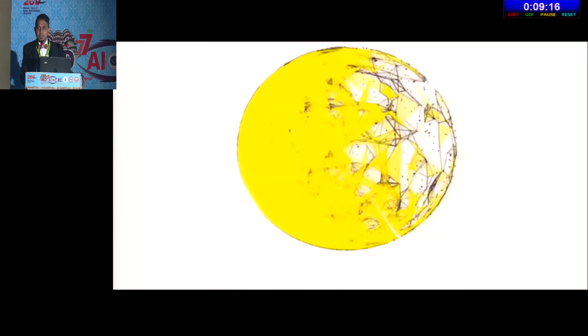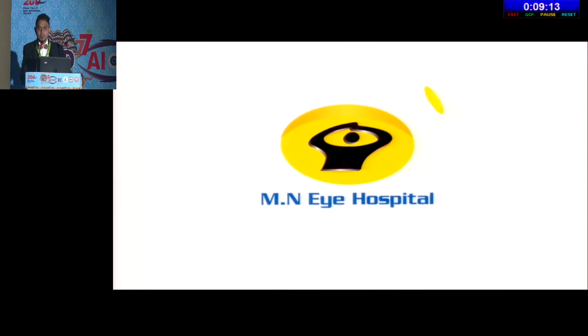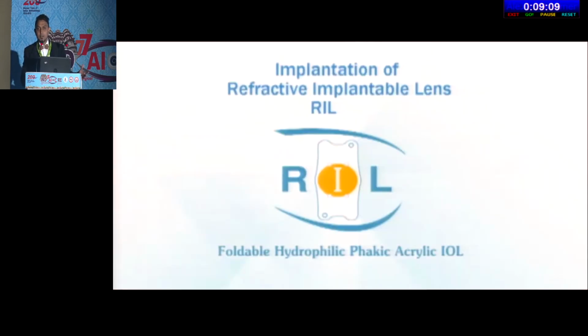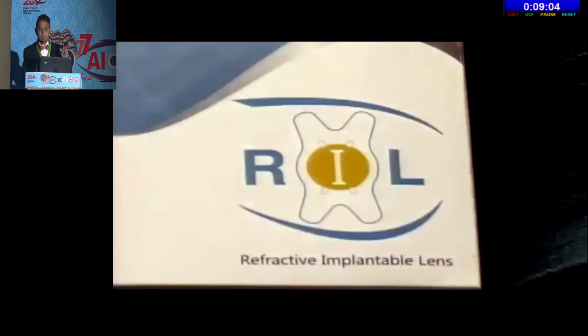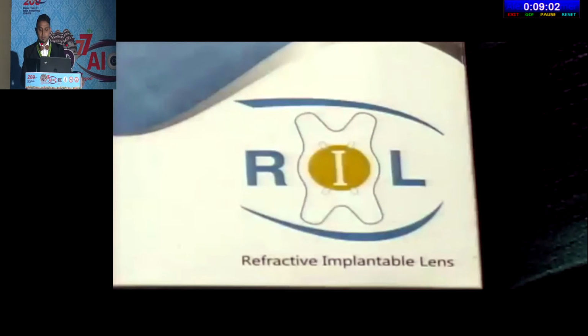The main thing is you load your own lenses. Always make sure you don't let the assistant load, because in the theater there is only one person to blame, that is the surgeon, not the assistant, not the trainer, and not the assisting doctor either.